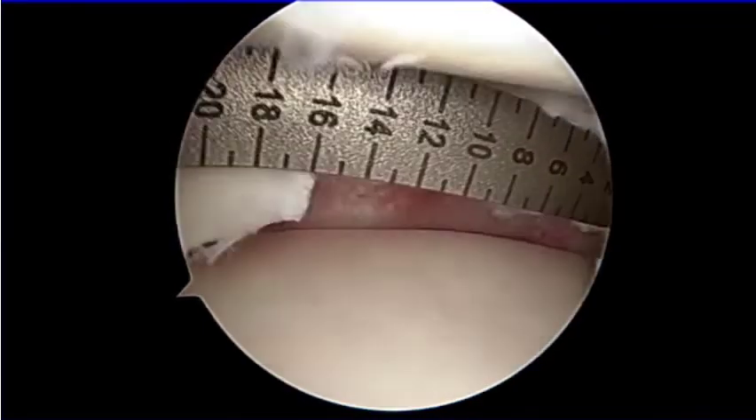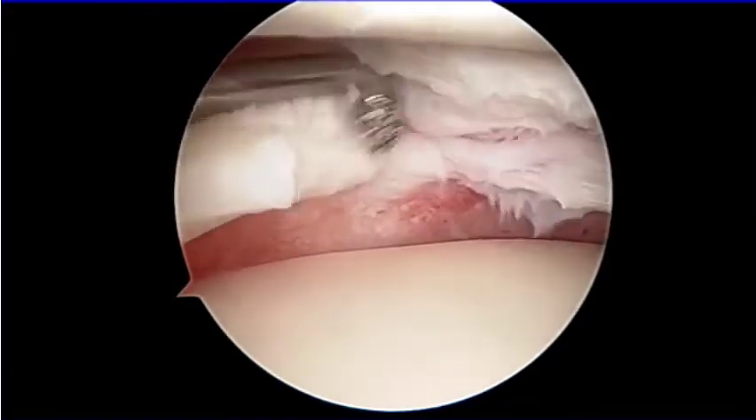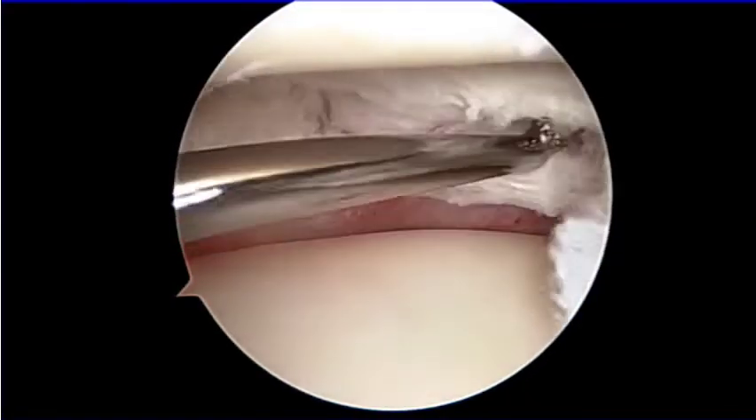The edge of the remnant meniscus was considered sufficient to stimulate meniscus cell regeneration.